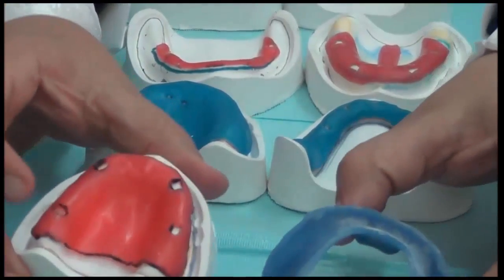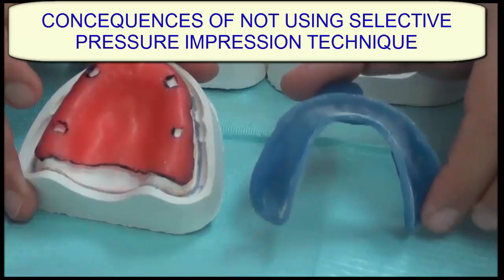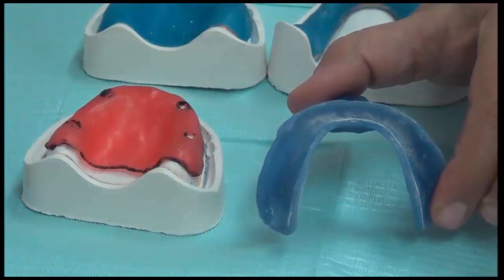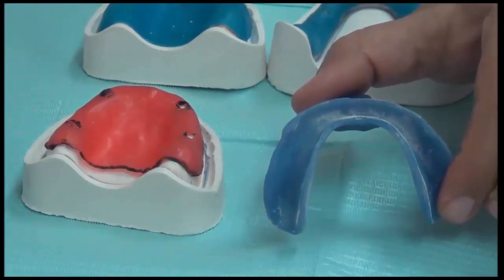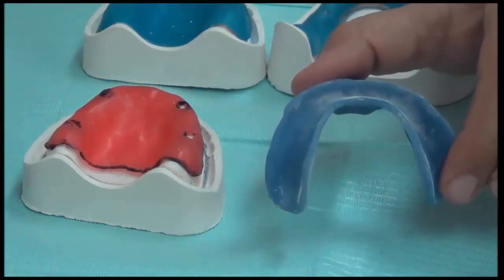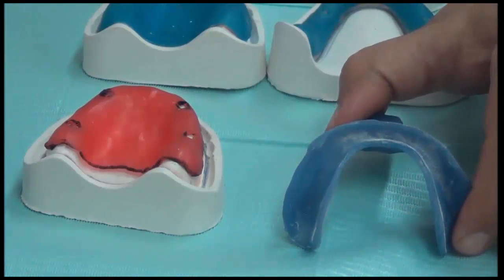But if we have the case of full wax relief or no wax spacer relief with no holes, what will happen is either all of the impression material will be compressed against the soft tissue, and we will have problems later with the compression of the soft tissue in hazardous areas like the nerves, for example. The patient will have pain, or we will have resorption of the bone in the crest of the ridge, or we might have trauma to the thin mucosa around undercuts and maybe bulbous bone or a knife edge ridge. So pressurizing all areas equally could, in the long term or the short term, harm the patient.